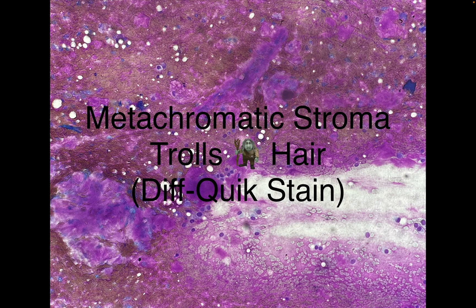Now that we talked about the Milan criteria, let's delve into pleomorphic adenoma. On this Diff-Quik stain, your telltale sign is this metachromatic fibrillary stroma that looks like troll hair — as in the movie Trolls, where you have those really vertical lined hairs.